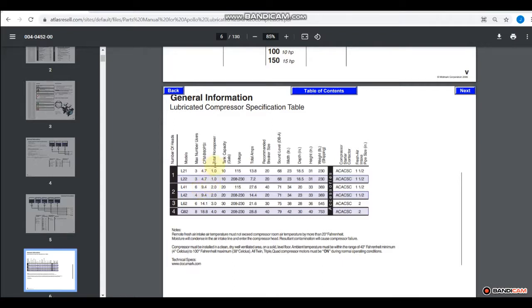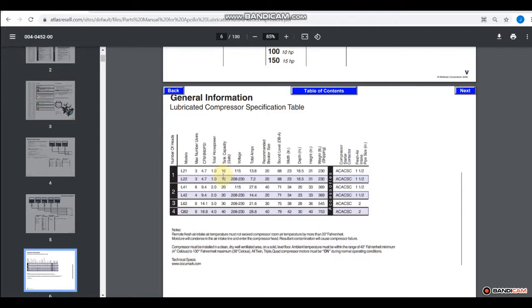So the horsepower on these compressors is listed here. The tank capacity is here and it's going to be either a 10 gallon, 20 gallon, 30 gallon, or 40 gallon tank. Now the purpose of the tank is to store air for after the compression cycle.